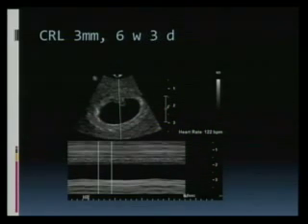Like in our ultrasound department, when you have a pregnant patient in room 1, where Renita usually is located, you have to do only one cycle, that is one systolic peak to the next systolic peak. One cardiac cycle only to be measured. Does that make sense? One cardiac cycle to one cardiac cycle. However, the machine which is in room 6 and all the machines that are in the ACC require measurement of 2 cardiac cycles. So that is vendor specific.